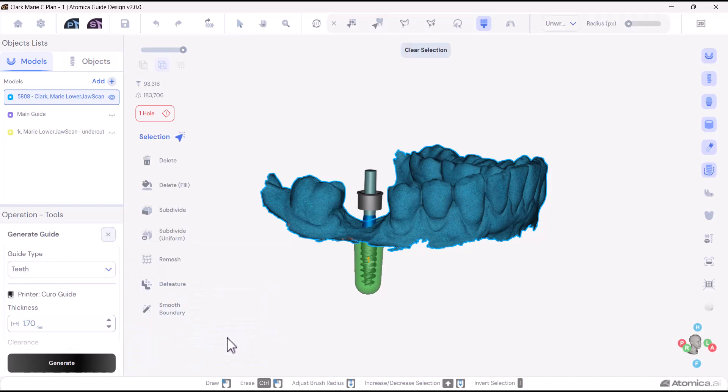Welcome to our tutorial on designing surgical guides. In this video, we'll delve into the key parameters that ensure your surgical guides are durable and fit perfectly. Properly adjusting these parameters helps us achieve guides that are neither too tight to fit onto the teeth nor too loose, ensuring they remain stable during surgery.